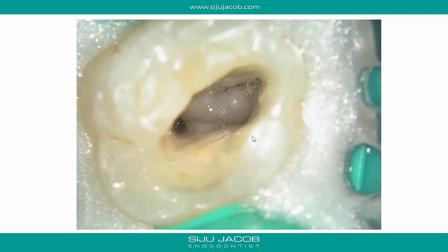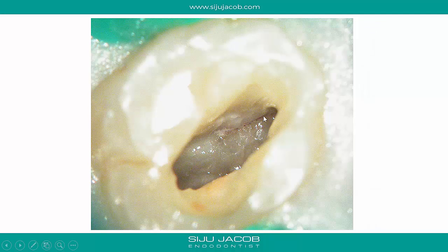If you are treating a vital tooth and you're observant enough, you can often see this trail of blood along that margin, which is a good clue that there is an Mb2 present under that ledge of dentine. But it's important not to plonk your instrument into that red line. When you see a red line, there's a temptation to poke underneath that. If you do that, there's a very high chance of ledging whatever canal's there.